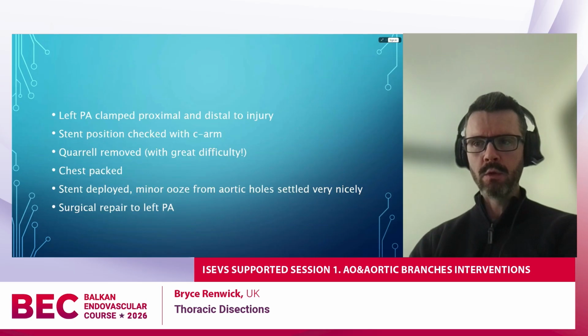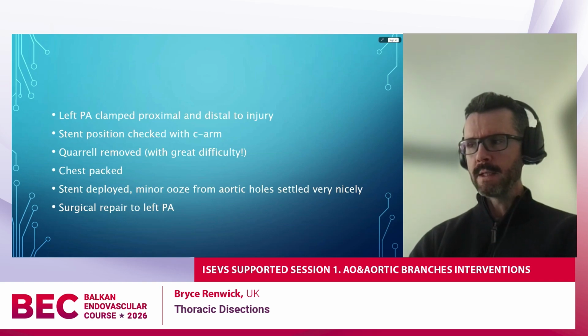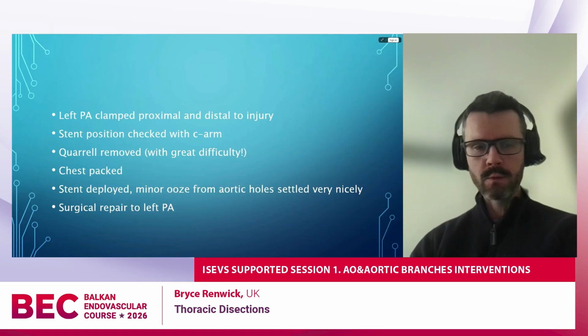This man was on single lung ventilation to the right by this time. Had a quick check of the stent position with my C-arm, and then we, with great difficulty, removed the quarrel. And this involved significant force having to be applied to the chest. So my worry about the quarrel being unstable was probably unfounded, but I didn't know that when we planned this case.